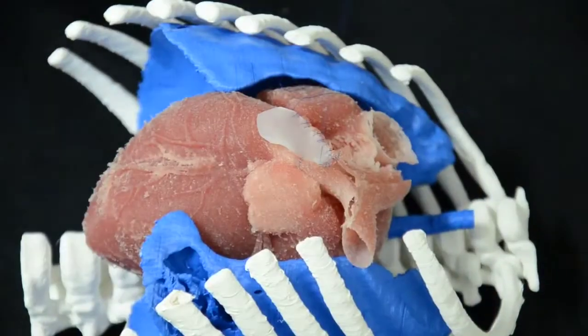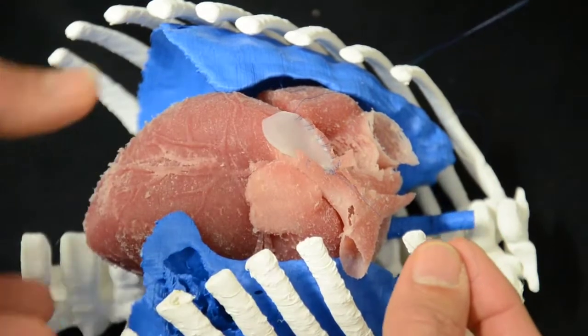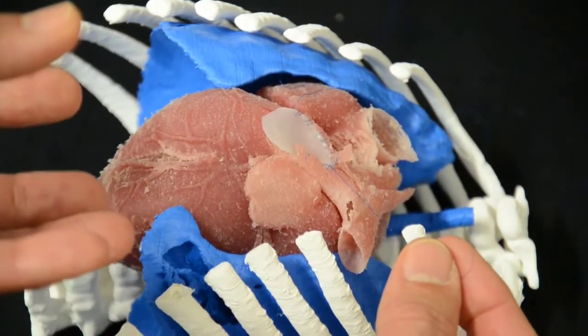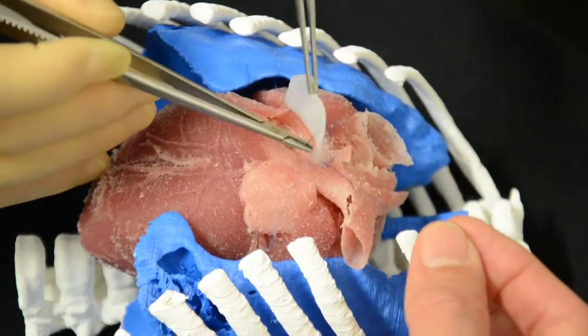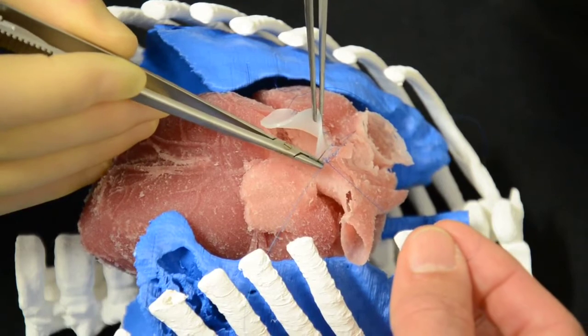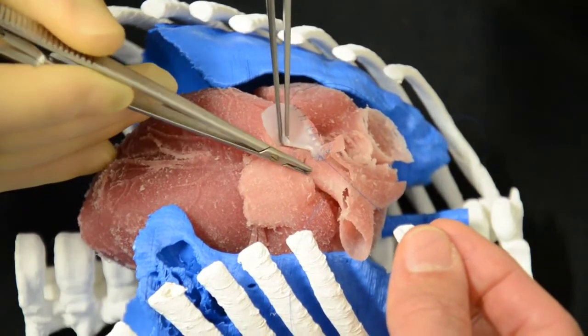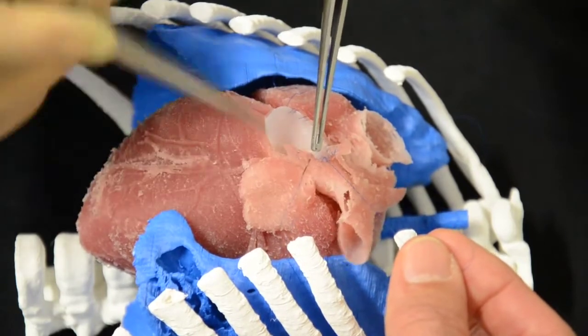So now we have nearly finished with one side — it's coming to this side. As you will understand, this is in front of us, but in reality when we do the operations it's quite inside the chest. It's very different there — slightly different the position of the heart — so normally it's a bit more difficult.